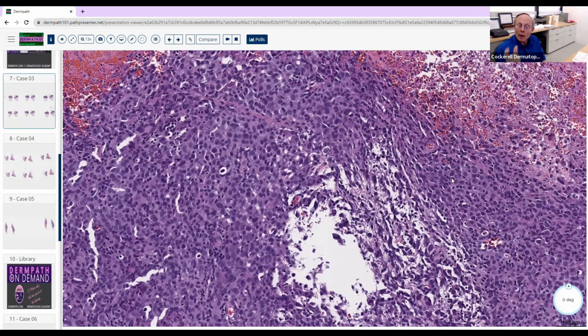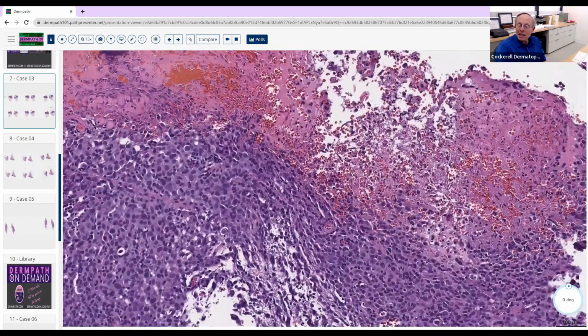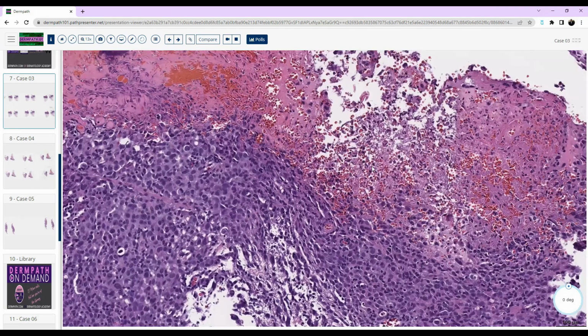So remember, epithelioid means it looks like an epithelium. It's not really epithelium, but it looks like it. And histiocytes can also assume that morphology. Now, when you're looking at granulomatous dermatitis, is it usual to get this kind of thing going on? No, definitely not. It's bizarre to get this kind of ulceration and whatnot. And maybe it's dealing with something like we talked about before, a suppurative granulomatous dermatitis with pseudocarcinomatous hyperplasia, but this doesn't have any epithelium here really that we can see, right? It's just kind of ulcer.